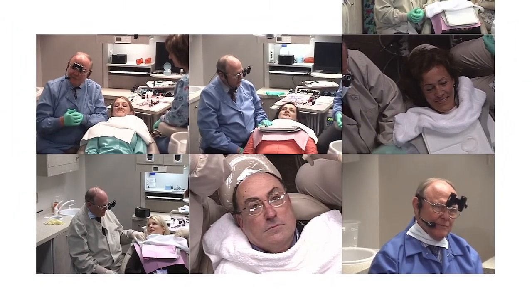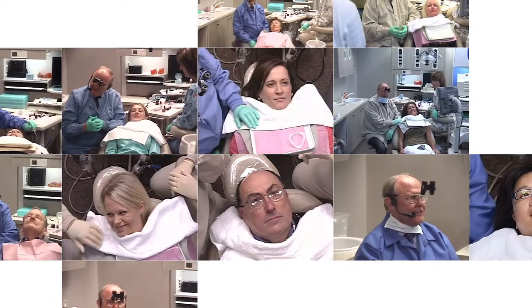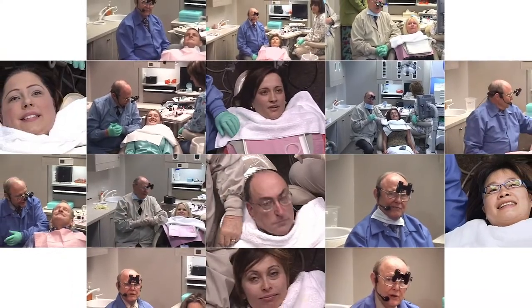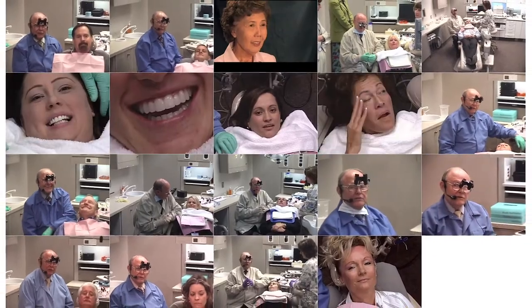She lectures in Buffalo, New York, Atlanta, Oklahoma, Vancouver, Canada, Boston, Kansas City, San Francisco, Montreal, Munich, Germany, London, Santa Maria, California. Now we're going to place lumineers on our patient today.